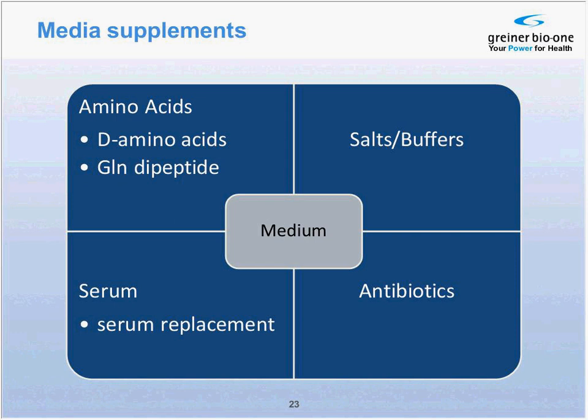Glutamine is a very important nitrogen source for the cells and is usually supplied with the medium. However, it's very common that glutamine dipeptides are added instead of the glutamine because they are more stable than the actual glutamine.